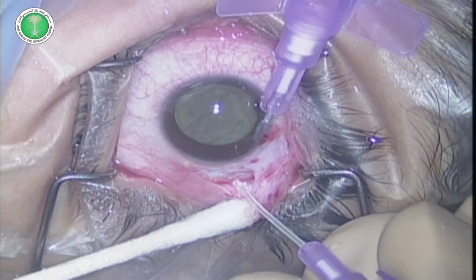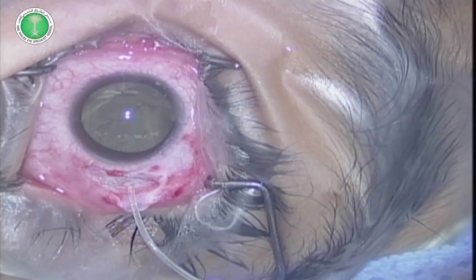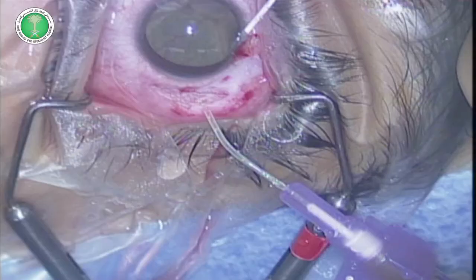After fixing the AC maintainer, the 26-gauge cannula is introduced into the subretinal space. Subretinal fluid has been collected in the syringe.